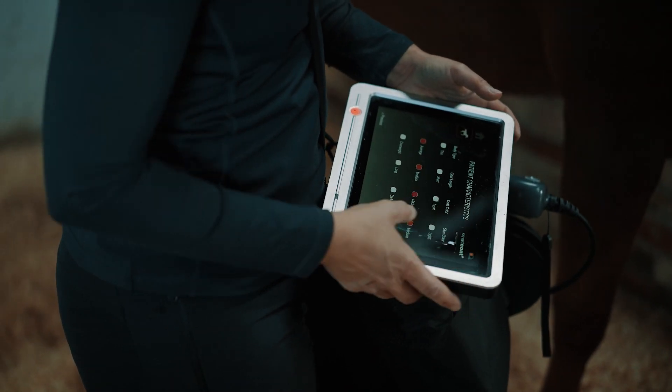I can program it easily. I can choose any program I like and I can use it in the box or in the field for young horses — I've even brought it out several times to treat them in the field.